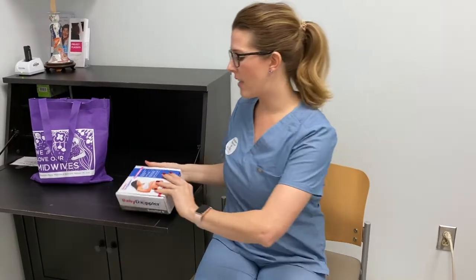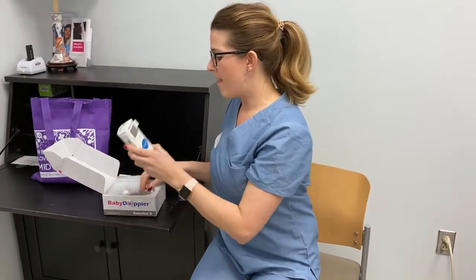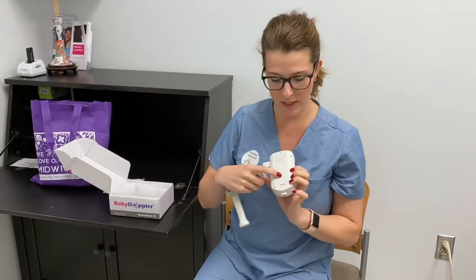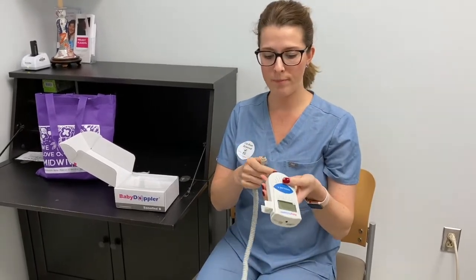Also in your kit, you get your doppler so that you can listen to your baby's heartbeat. It will come in a box, and in the box, you've got instructions, just like on your blood pressure cuff. And then the doppler comes in 2 pieces. Of note, you need 2 AA batteries for this, and they are included in the box. I've already put them in. They're not included in your blood pressure box.